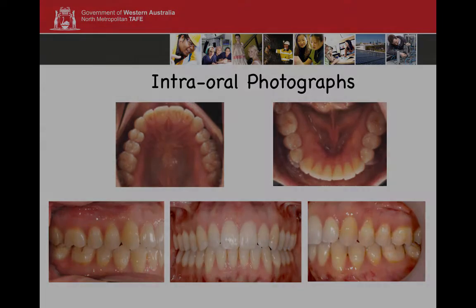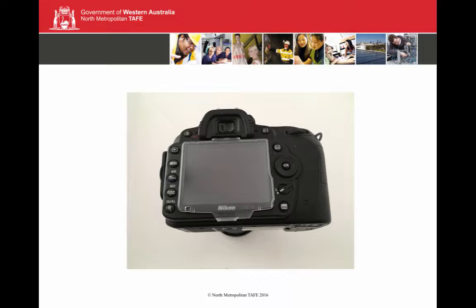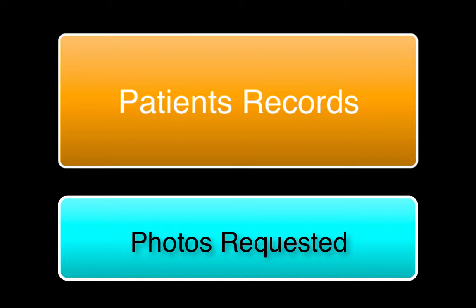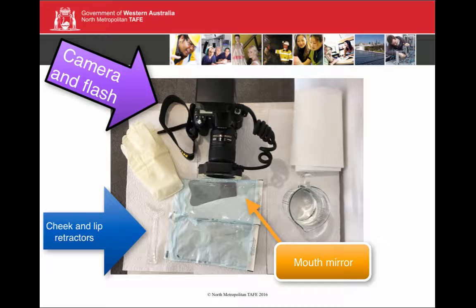Although recommendations for the aperture are provided, they may differ depending on the camera used. It is also recommended that you check each photograph you have just taken by looking at the screen at the back of the camera, so that if it hasn't worked you can delete it and retake the photo straight away. Remember to access the patient's records to see what clinical photographs have been requested, then gather all necessary equipment including the camera, flash, sterilised cheek and lip retractors, and mouth mirrors.